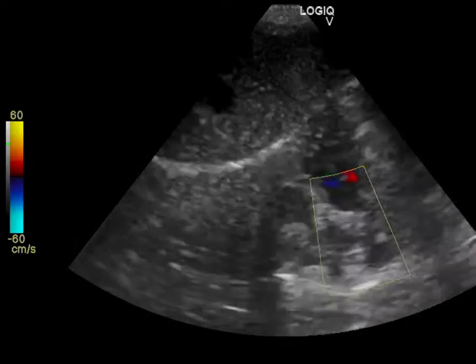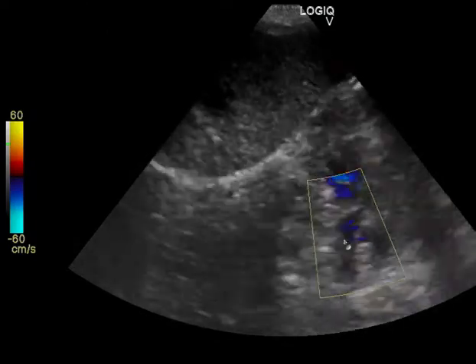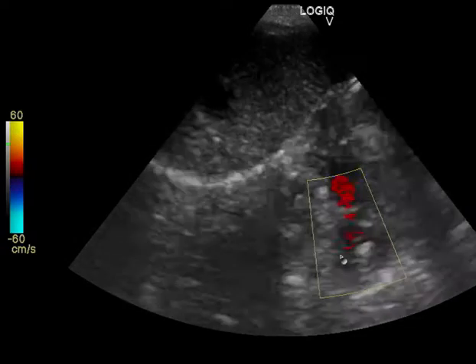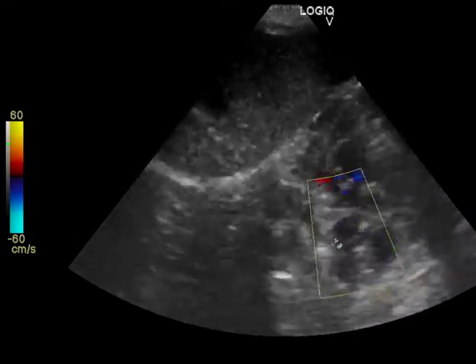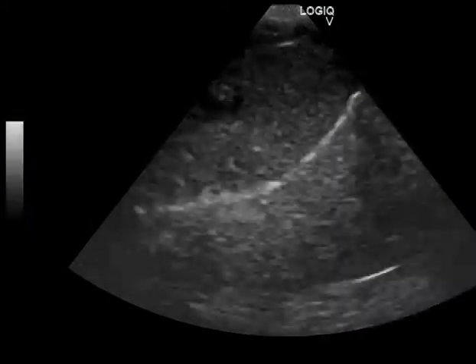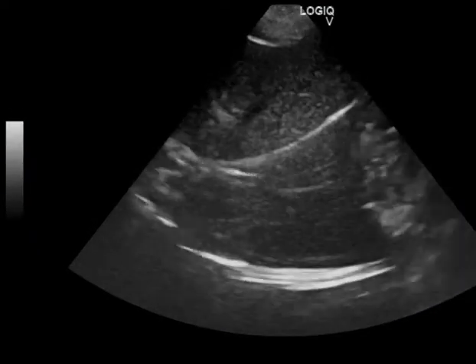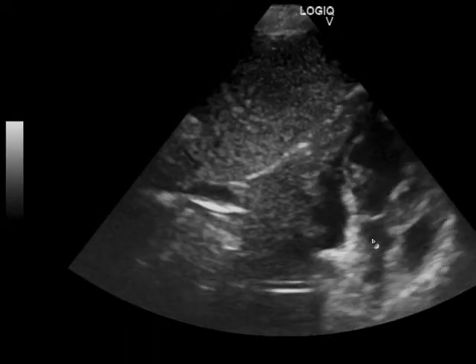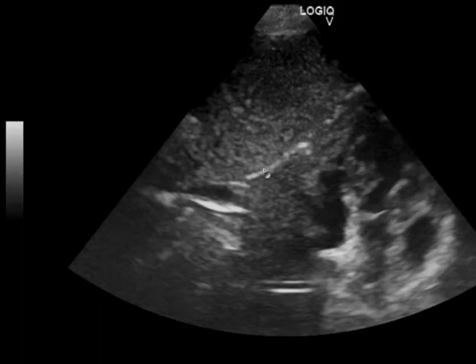Nice apical view — you just have to flatten the probe a little bit more onto the body wall, and as you flatten the probe towards the body wall further, you will center that heart. Nice morphology on the mitral valve there. For color flow: don't put your color flow until you have a nice wide clean aorta — if you start with a less than ideal image your color flow is going to be less than ideal. You want a consistent long aorta in the center of the screen, then color flow, then the spectral.